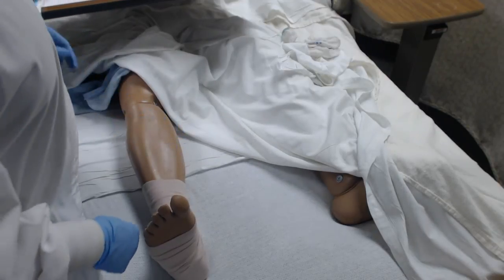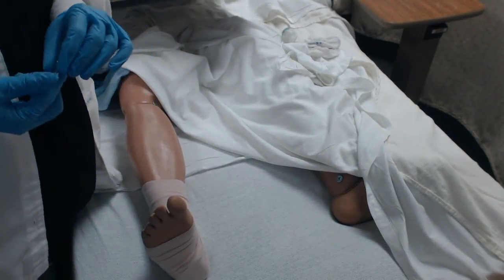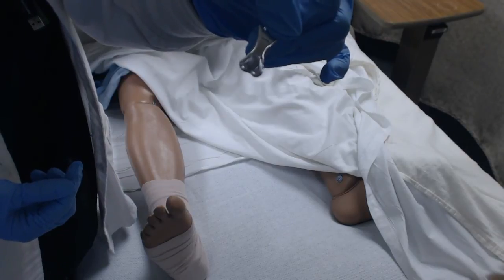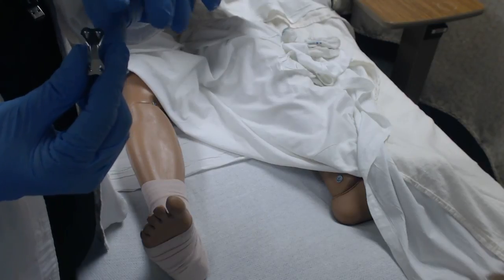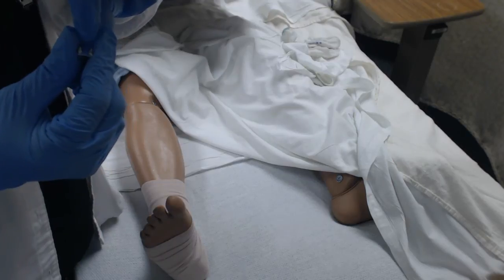So then the biggest thing with a TED stocking, or an ACE wrap, I'm sorry, is you get these little metal clips that come with them. You don't want to put these on the patient. That's because the back of the metal clip has these prongs that are very, very pointy and very sharp.